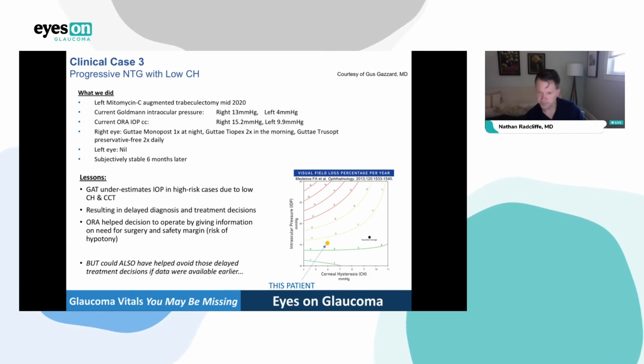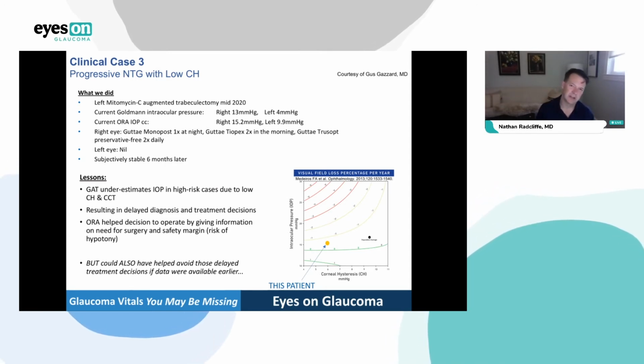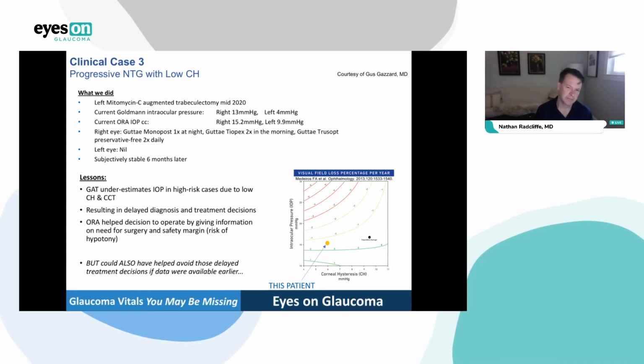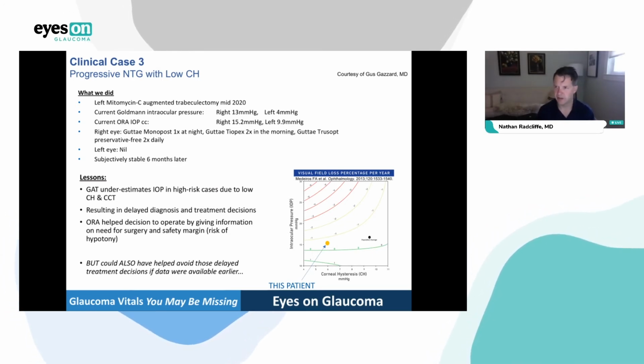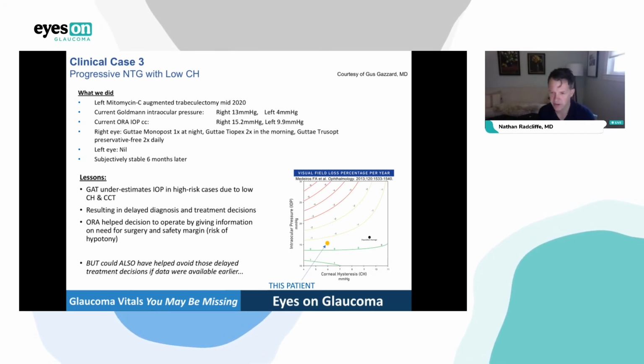I had a question here. Do you use corneal hysteresis to set a target pressure? And I certainly do. I think this would be a good example. Now, I also want to take a step back and say, I'm not one of those glaucoma specialists who goes around setting target pressures of 8 and operating on everyone. I generally think most people are going to be stable if they get to 12. 10 to 12 is sort of your dream range. 14, 15, 16, moderate glaucoma might be okay, borderline for advanced glaucoma, that type of thing.